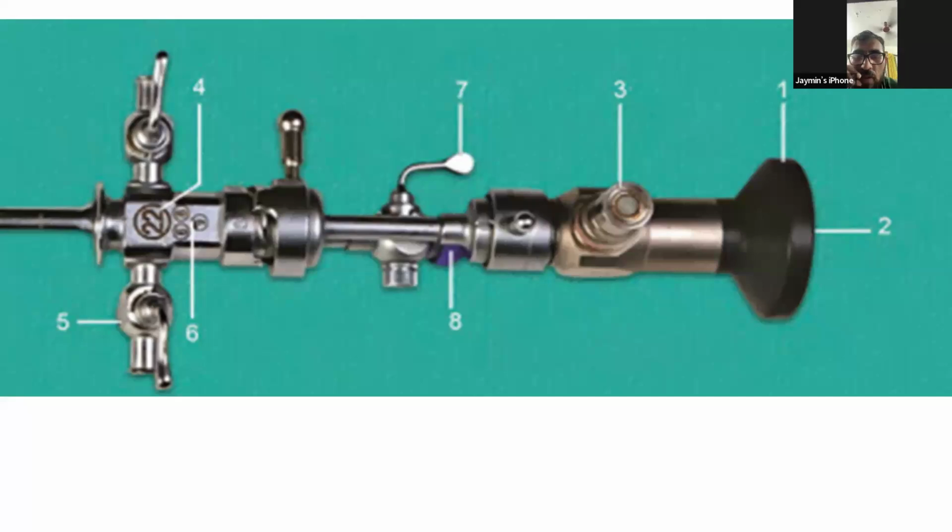This picture depicts an integrated system of a sheath with bridge and a telescope, sir. Why are you saying it is integrated? Integrated as in connected, assembled, a ready-to-use cystoscope.